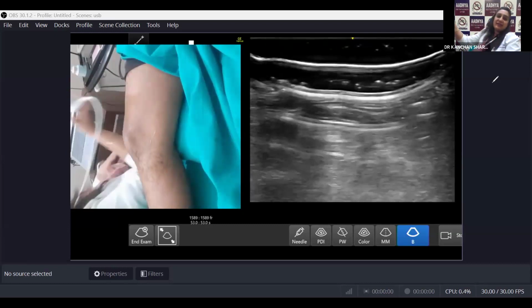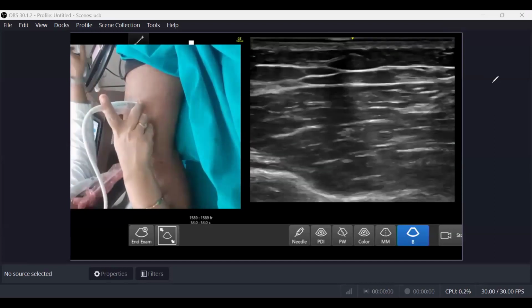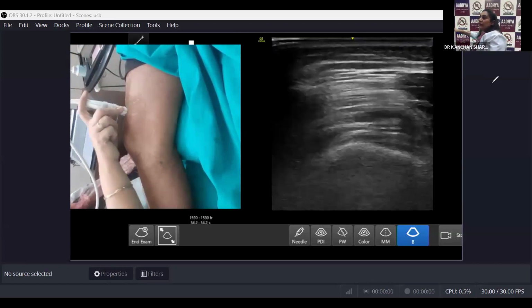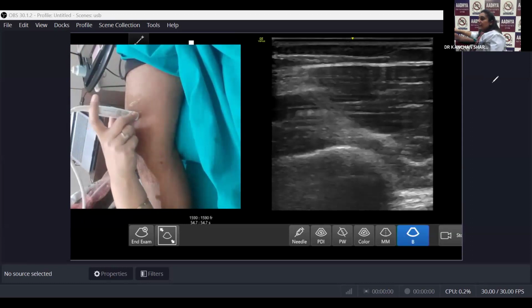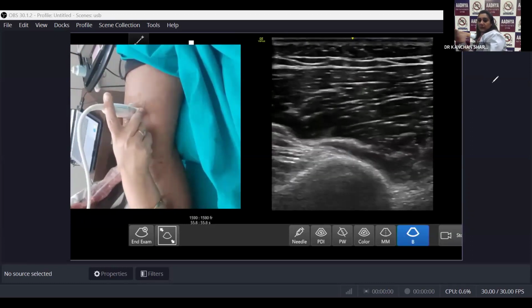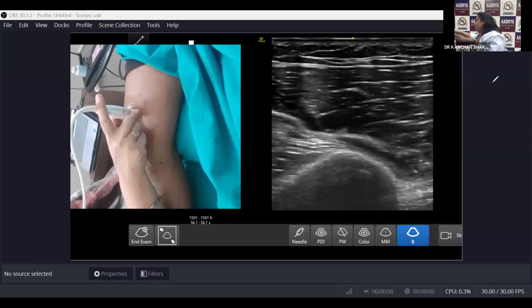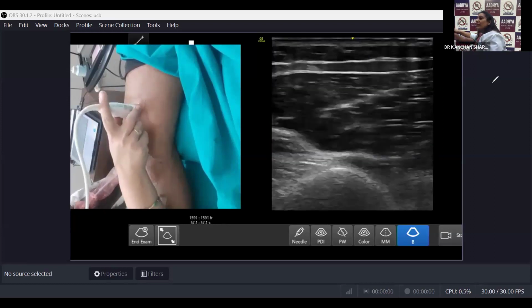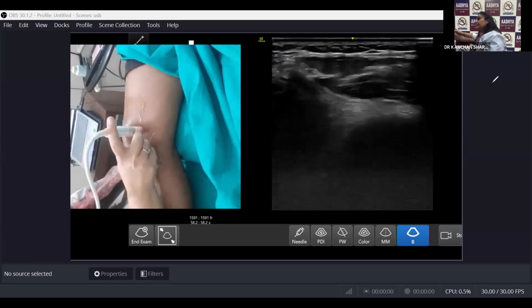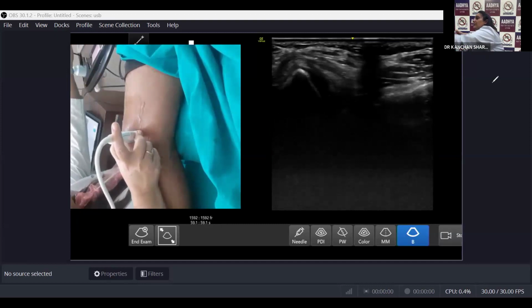So now go back to your vastus medialis. Here your friend is vastus medialis. I will increase the depth and then we will decrease it. So now I know that this is quadriceps tendon. Vastus medialis will be having a downward extension. So I will just make vastus medialis my friend and I will just keep on coming down, down, down, until it just goes away. And here I will reduce the depth.